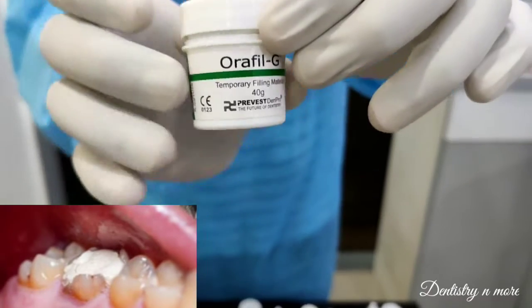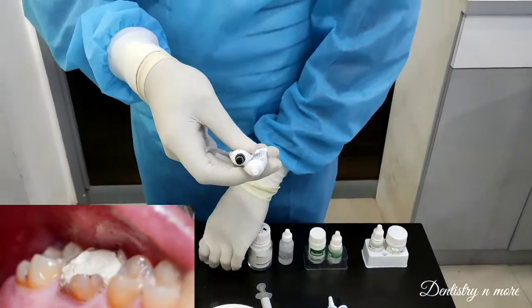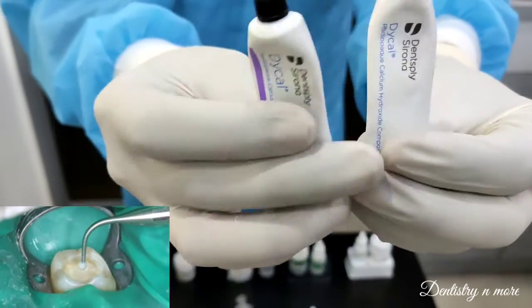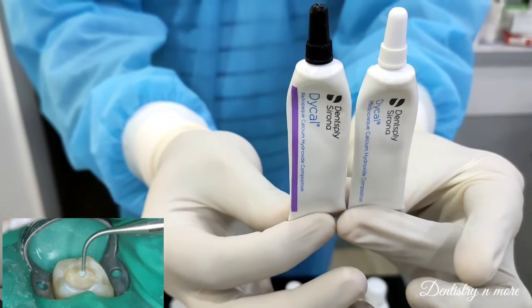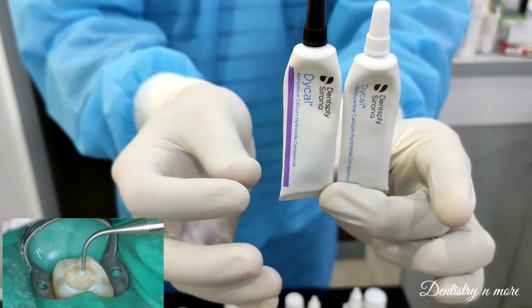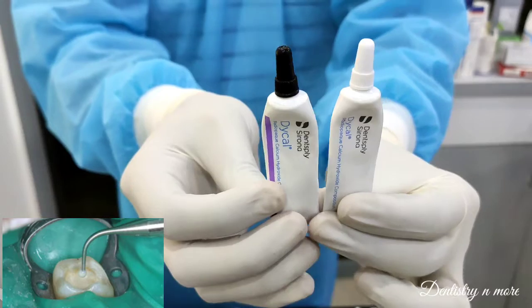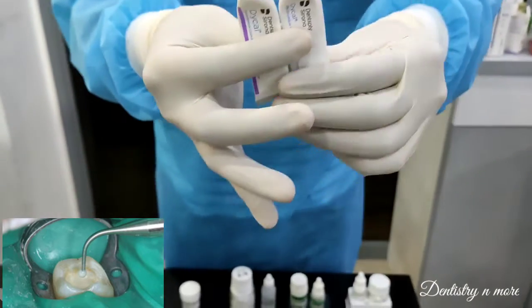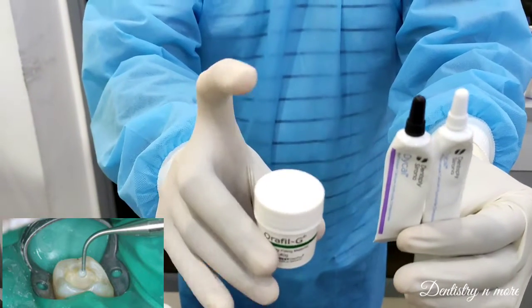Next we have Dical, which is calcium hydroxide, used in deep pulpal cavities where the pulp is almost exposed. It has a sedative effect and thermal insulation effect. It comes as a base and catalyst; we mix both and apply it on the deeper pulpal cavities. It has a healing effect on the pulp.